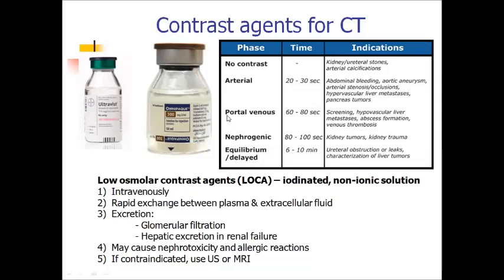Next is the portal or venous phase, up to 1.5 minutes. It's detection of the portal venous system and other veins of the abdominal cavity. And next, when glomerular filtration begins, we go through the nephrogenic phase.